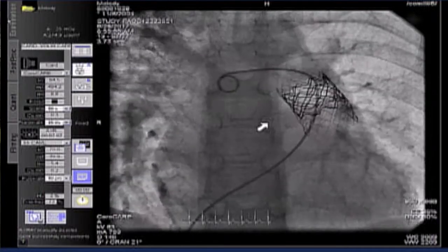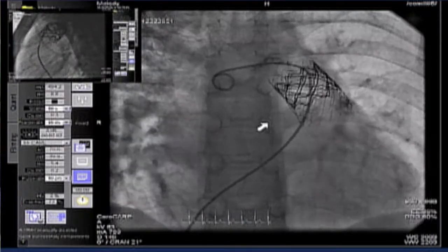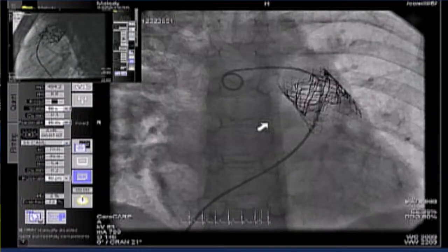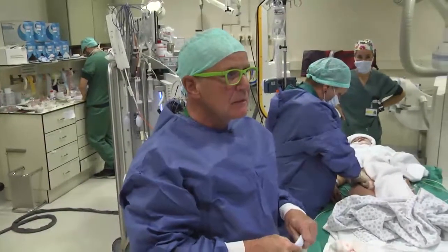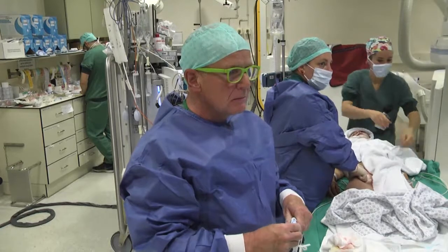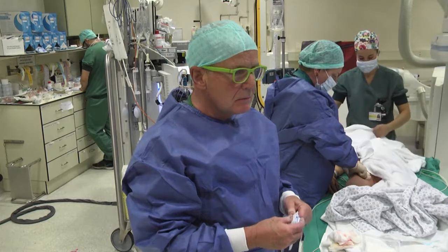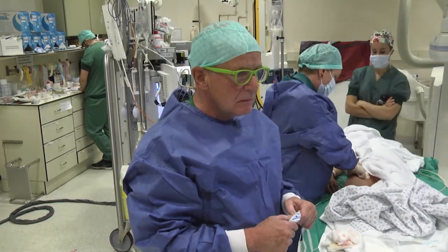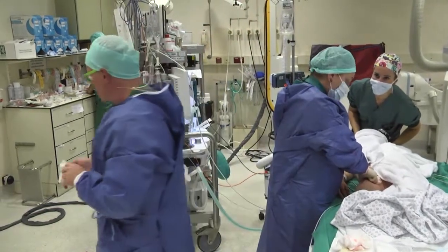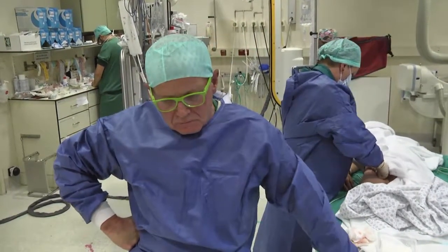Mark, John Cheatham. Just a couple of comments, because you were using the new Ensemble balloon delivery system that has markers as opposed to the old one that had no markers. I was just wondering, because you have to do a fair amount of manipulation when you fold the Melody like you did. You went from a 33, 34 and expanded to 22, but you have to do a lot of manipulation, and you had to make the outer covering bigger. Do you ever, just like we do with BIBs in general with stents, do you ever fluoro it to make sure you're exactly where you want to be, as you have made so much manipulation, and then the first time in it was too far? That was the first comment.